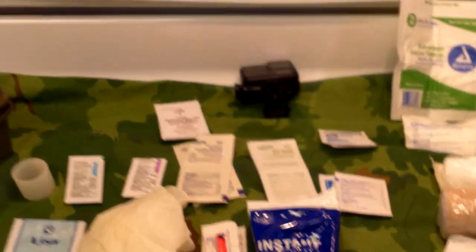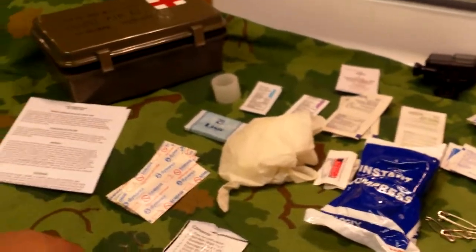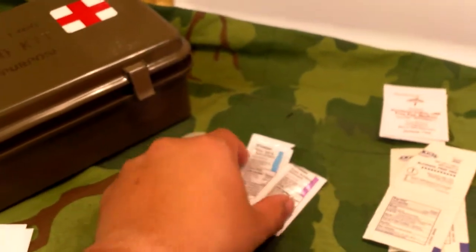Elite First Aid still makes these; I think this one was around $20–25. I really like this kit — it gives a nice variety of items. Definitely throw out the latex gloves since you don't know if someone you're treating has a latex allergy. Also throw out the expired pain relievers.